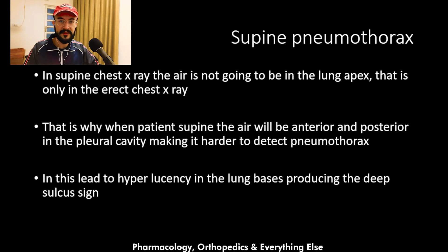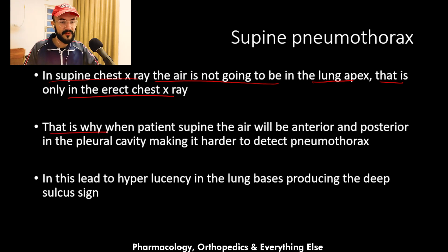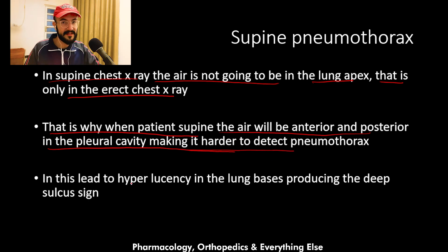In some situations we cannot get the patient to stand for the x-ray, so it is taken with the patient supine. In a supine chest x-ray, the air is not going to be at the lung apex as it is in an erect chest x-ray. When the patient is supine, air will be anterior and posterior in the pleural cavity, making it harder to detect the lung edge. However, in supine patients, there will be hyperlucency in the lung bases producing the deep sulcus sign and other signs that help diagnose supine pneumothorax.